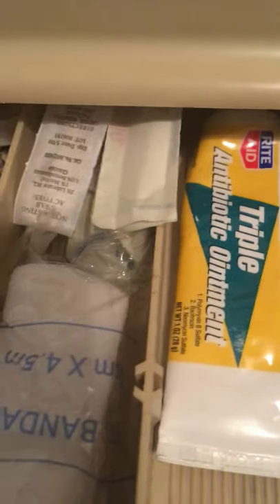Here's the second layer and the top layer, just if you didn't get a good overview of that. Then some roll gauze, some anti-itch cream, triple antibiotic ointment, some sting relief, and another roll of gauze.